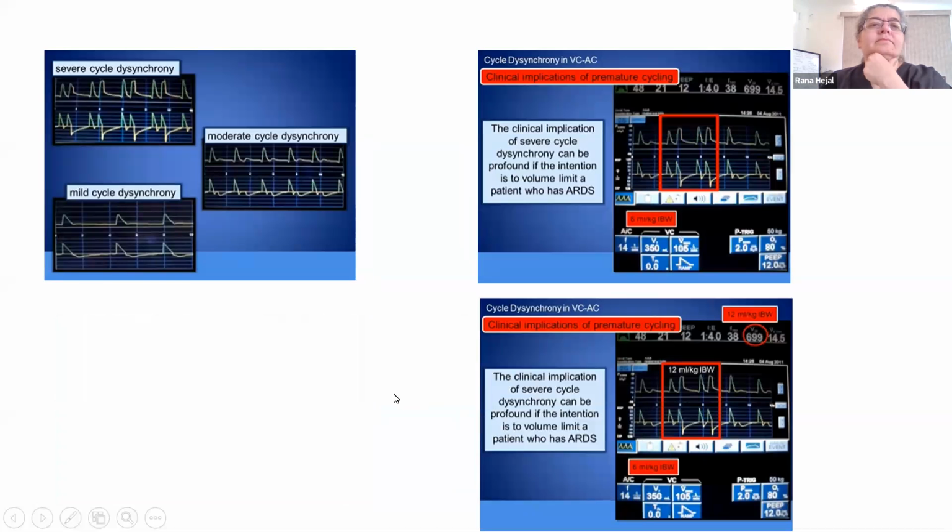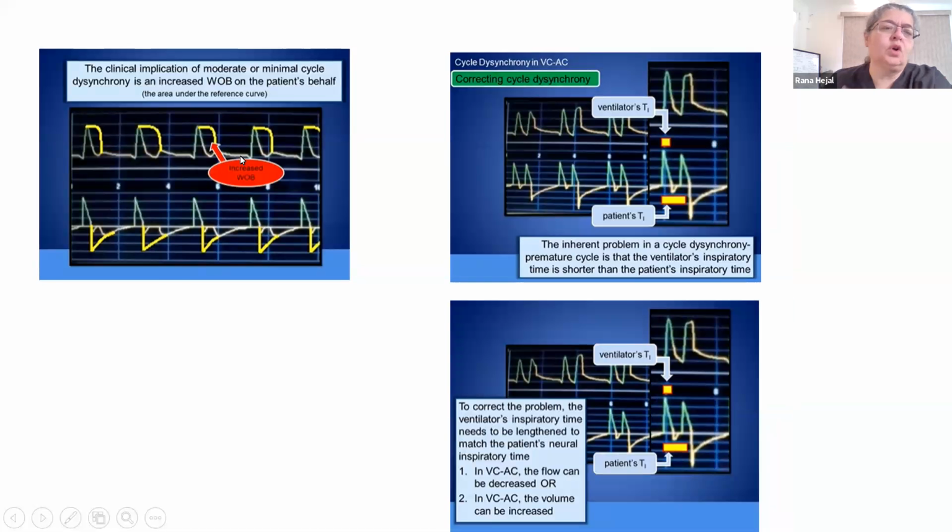This is kind of a summary slide. It's nothing really important. Oh, this is what I mean by... I don't even remember my slides. So this is what I mean. If this is what it's supposed to be, the ventilator support, this is how the flow is supposed to be, but it is not. So you see the end of the expiration in the right direction, but there's something in here that is being recognized by the ventilator. So all this work here that is being done is done by the patient.